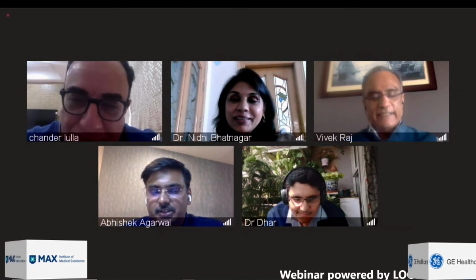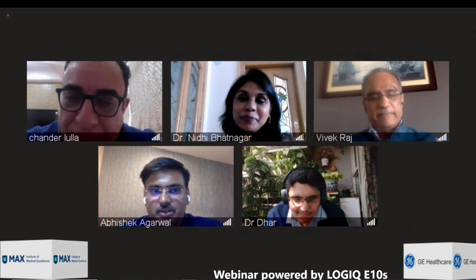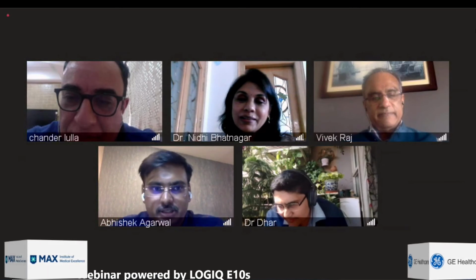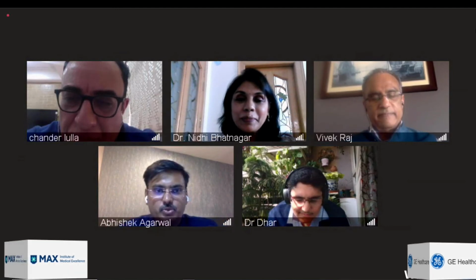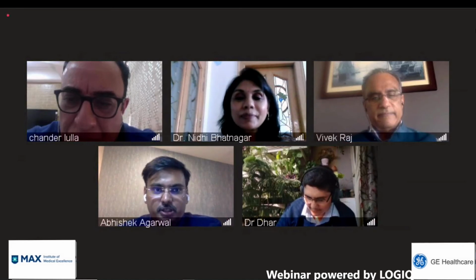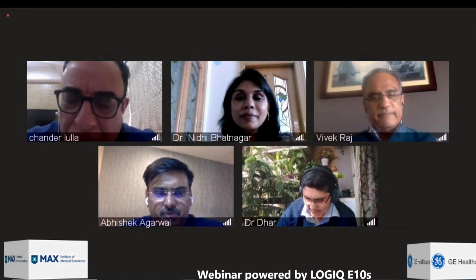In the talks of Dr. Nidhi and Dr. Lulla on the 2D elasto measurements, I saw a little bit of a difference. Dr. Lulla, on your 2D elasto, on a single measurement or a single box, you don't take a lot of measurements, maybe 1 or 2.